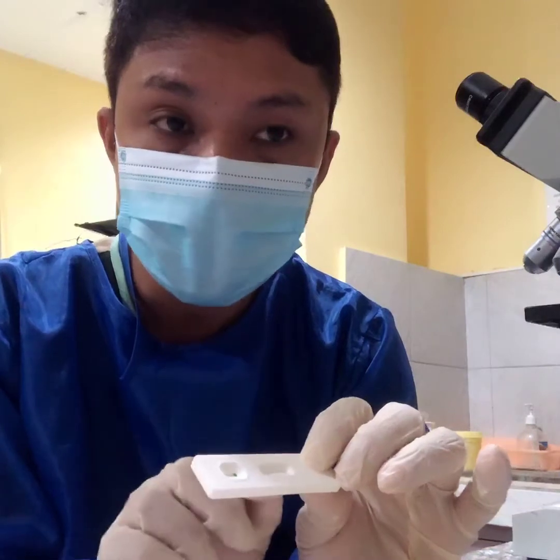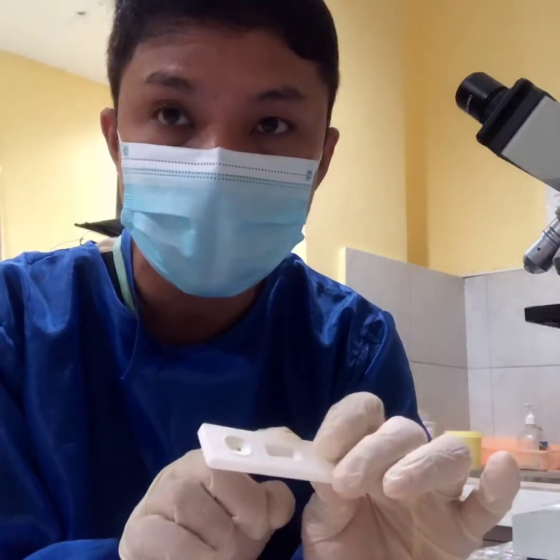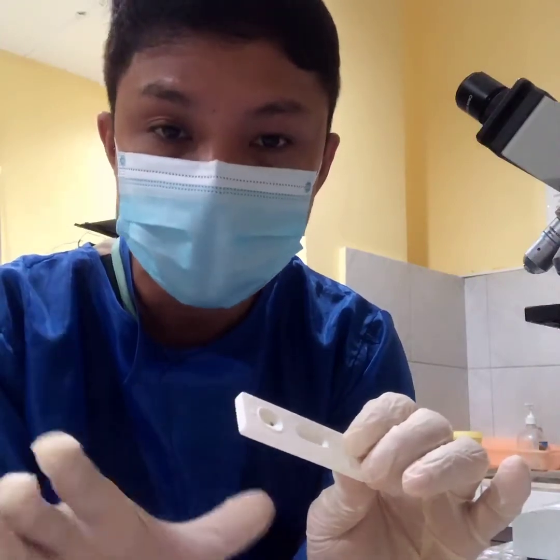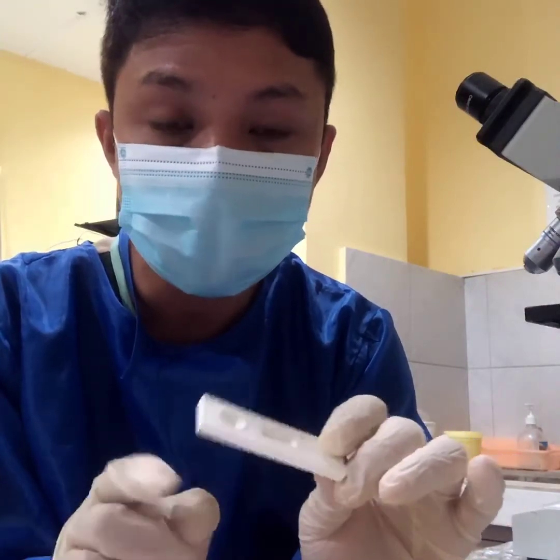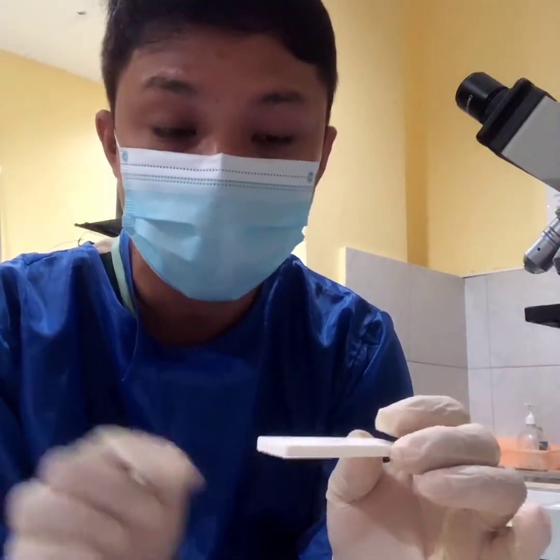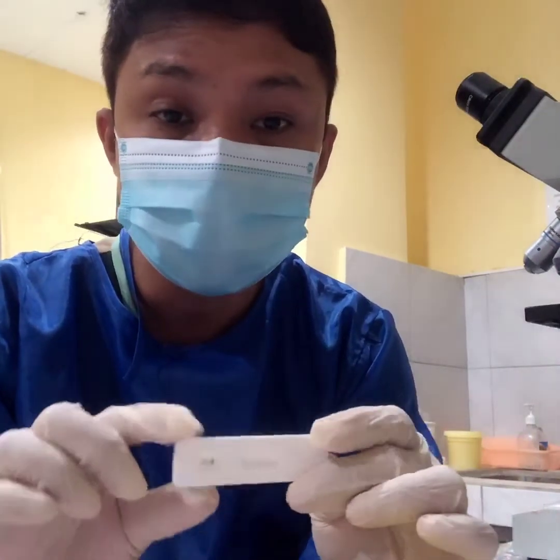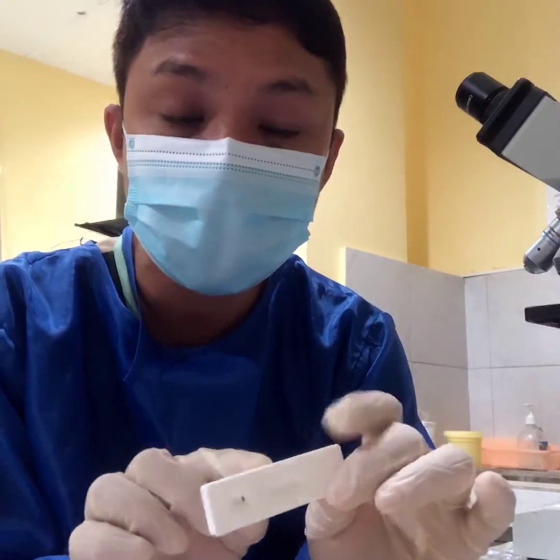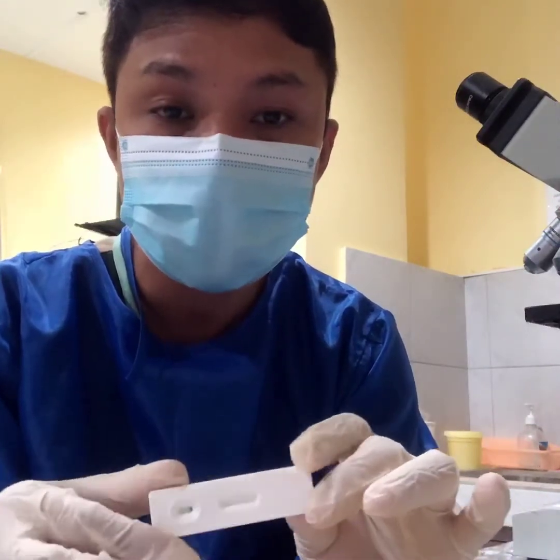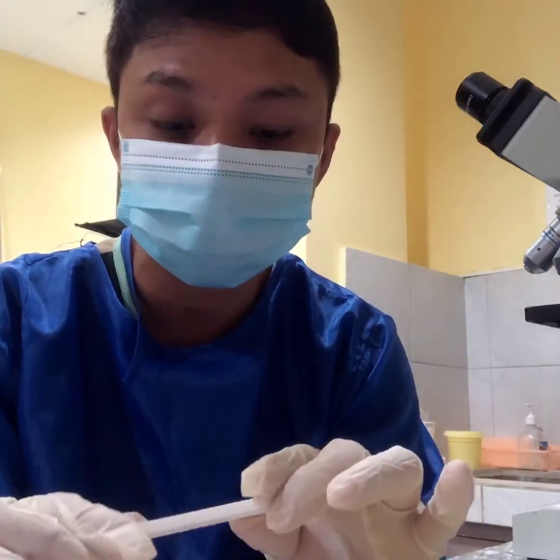At the same time, it's also impregnated with another antibody containing a colloid conjugate, which is responsible for carrying or giving the color reaction. In the end, the reaction is the formation of a purple band or line, signifying a positive test result.